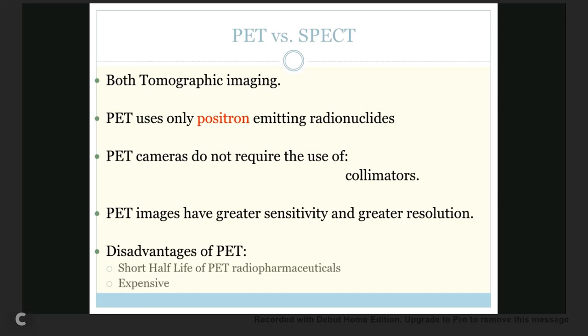Okay. But it's a different type of setup, so it does have something, but it's not like the collimators. Remember that the PET photons go at 180 degrees, so what's happening is that it still needs to hit those detectors. It has a focalized point where it's going, which is 180 degrees in two different opposite directions.